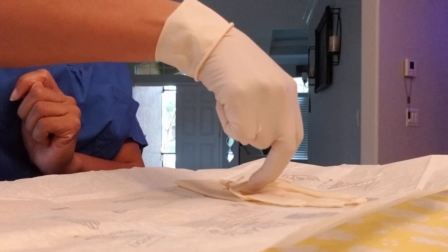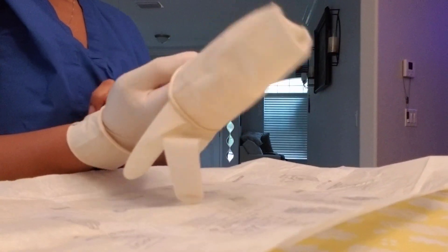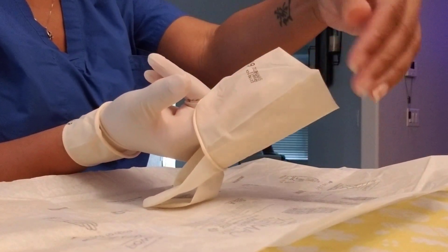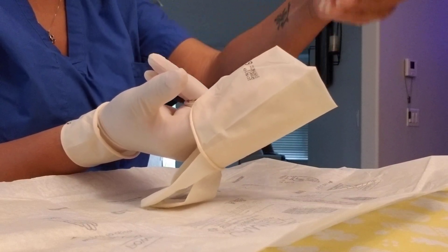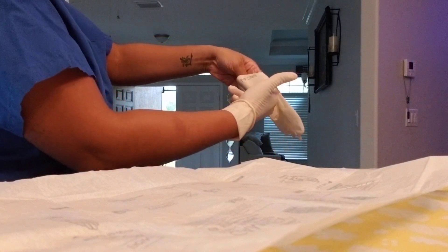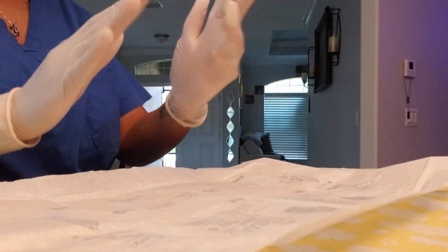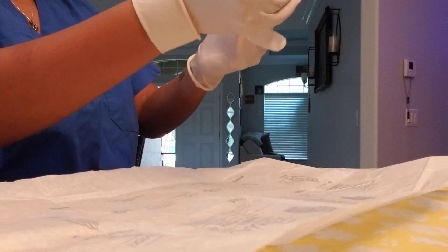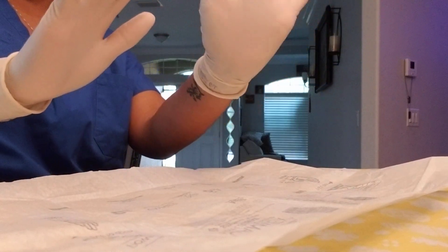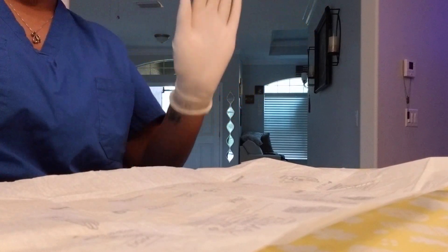Take bunny ears, go into the cuff of the other glove, and don't put your thumb out here — because once your hand touches there, all of this becomes unsterile, since that's what's going to flip down and touch your skin. Pterodactyl in, pull out, slide the glove on. Now fix your fingers — it's your tendency to want to fix it, but let it be. Don't touch it; you're away from everything.